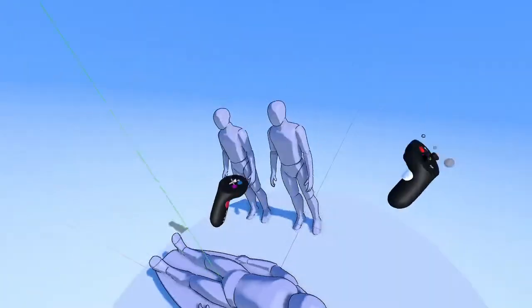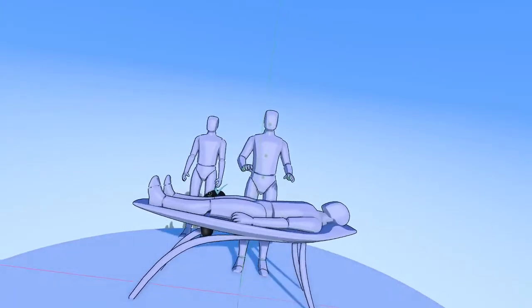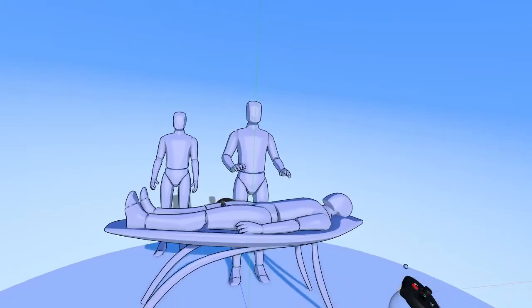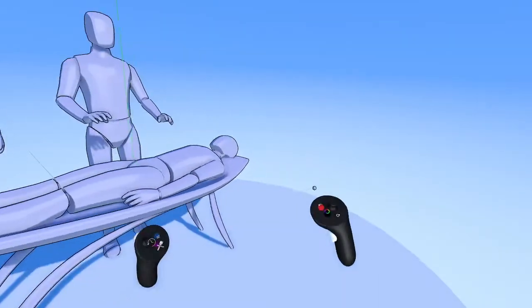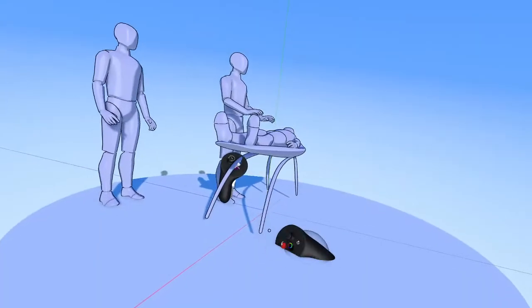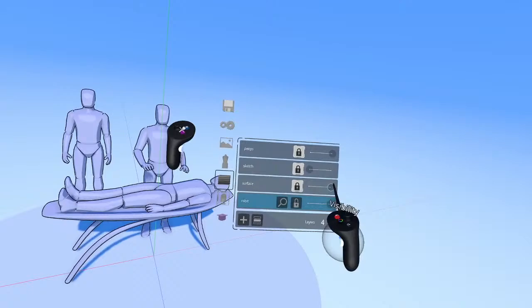Actually, before locking the people, let's move the doctor forward a bit here and just see, arm height wise, are we correct here? This is one of the nice things you can do in Gravity Sketch: because you have these models, you can evaluate the ergonomics or the usability of your product pretty accurately, I should say. What I'm seeing is that this is a little bit low. So I'm going to group the table and the guy here and shift that up a couple of inches. I think somewhere around 3.5 inches is good. We'll add some beefy tires to this table in a little bit, but for now this is good enough. This lets us know that it's a comfortable height for him to be working on. And we can lock the people, and we can lock the table as well.